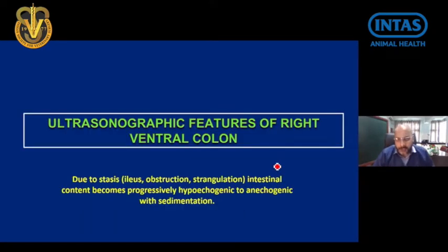Then the ventral colon here. The take-home point from here is that when there is stasis because of ileus, obstruction or strangulation, the intestinal contents eventually become hypoechogenic to anechogenic with sedimentation. Initially, you'll find a mixed echogenicity of the fluid. As the stasis prolongs, the heavier material settles down and the fluid comes up, which leads to hypoechogenicity of the contents of the lumen.